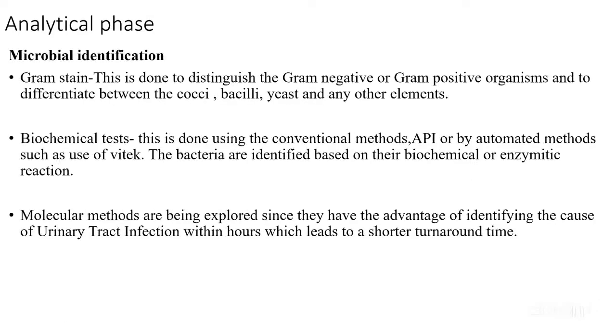So the next analytical phase, once you have gotten your colonies, you've identified they are pure, it's not a mixed colony. Usually in urine, we do not process cultures that are grossly mixed. We term them as contaminated because if you process a culture plate that has more than 4 or 5 organisms, most of them you'll find that they are contaminants of the skin. So we discard the plates, and if necessary, we request another urine to do the cultures.